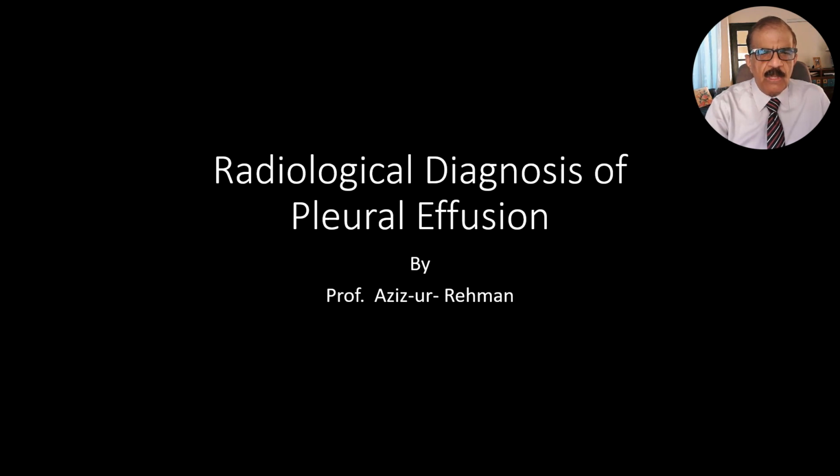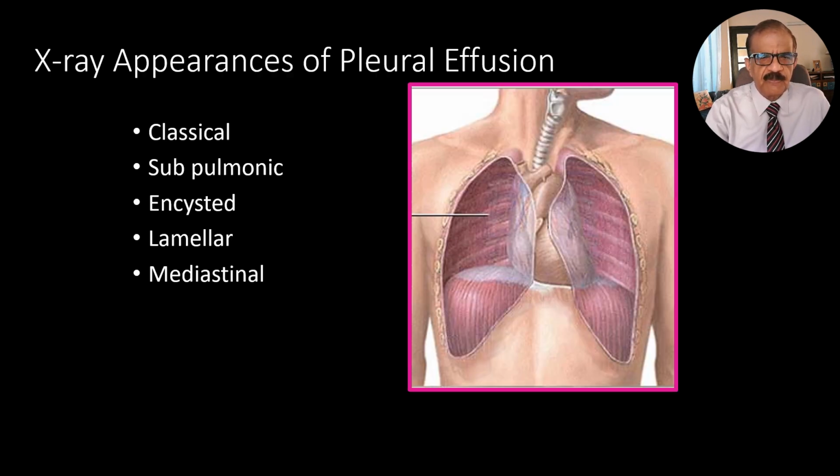This module is primarily focused on radiology, so I'll be mostly covering the radiological part. The clinical parts will be covered in a separate video. Now, before we see the radiological appearances, this is just a cartoon, a drawing, which can show you what type of shapes pleural fluid can take when it accumulates.